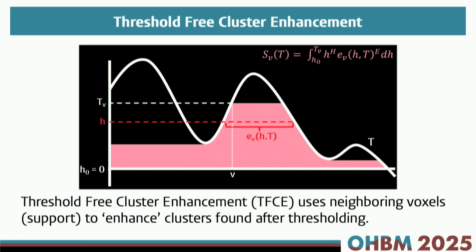If you set the threshold here, you will see this hill as an activation blob, this hill as an activation blob, and this one is gone, right? So setting the threshold mainly depends on how many clusters you find. If you set a high threshold, you find little peaks, but with a high statistics value. If you set a low value, you find more blobs of activation.